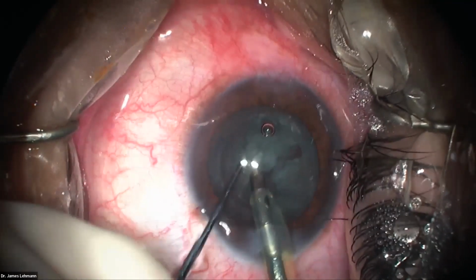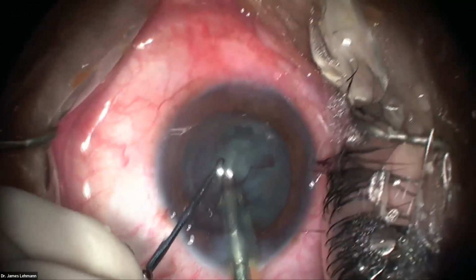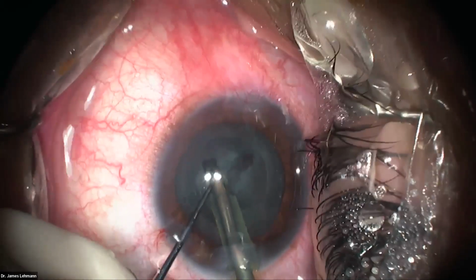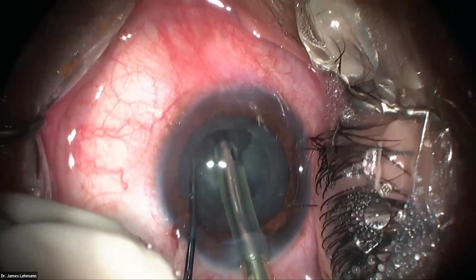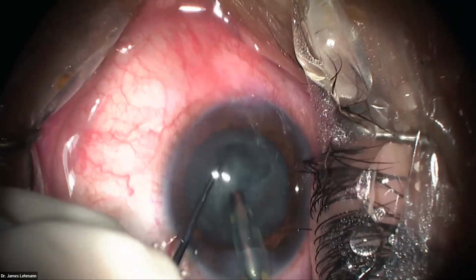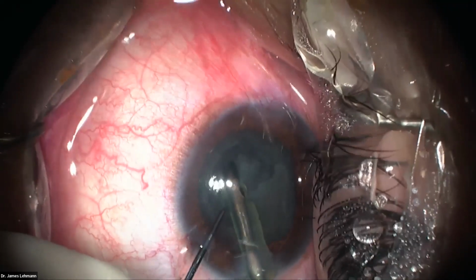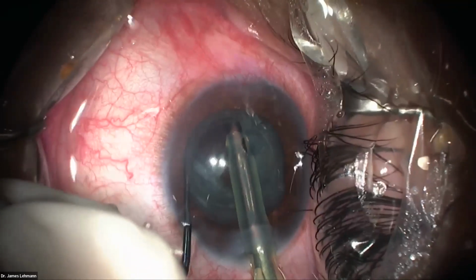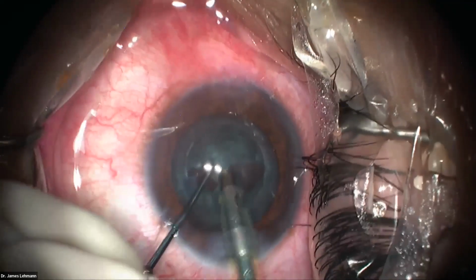Now we're going to go back to where we were. This is kind of 180 degrees from where we started. And then break this last little guy. I don't think I went deep enough there in the middle. It's pretty dense right there. So there we go. Get that last piece. There we go. And then we're going to go just across here, do that last quadrant.